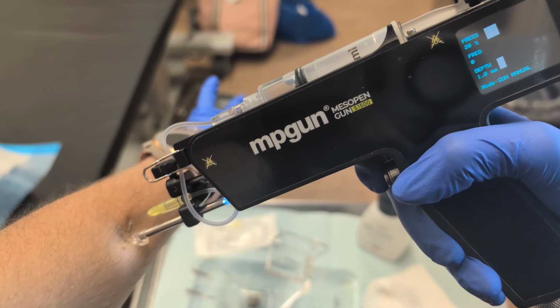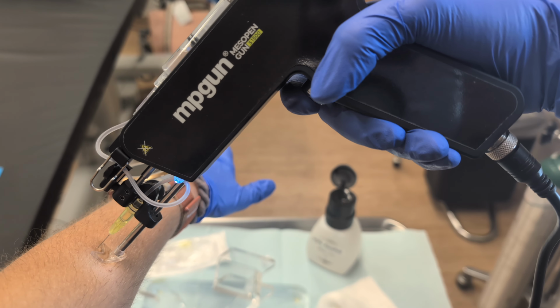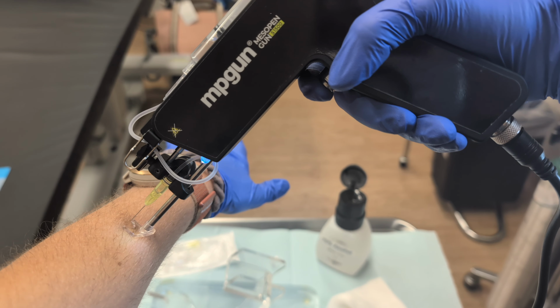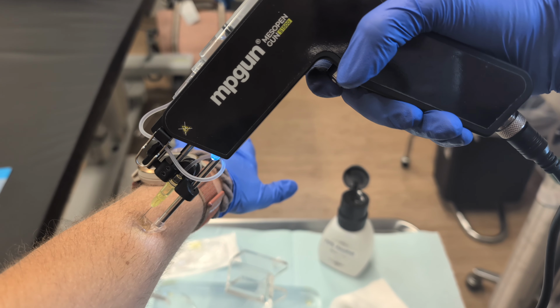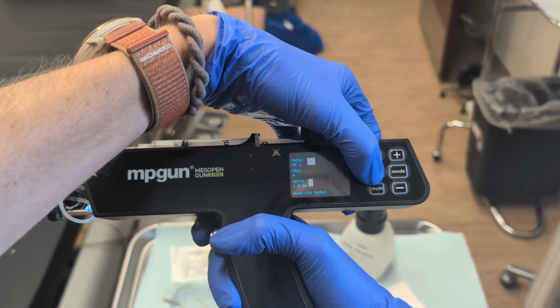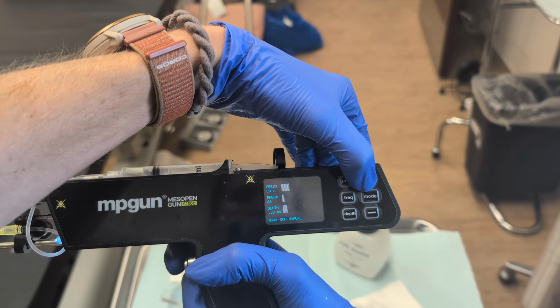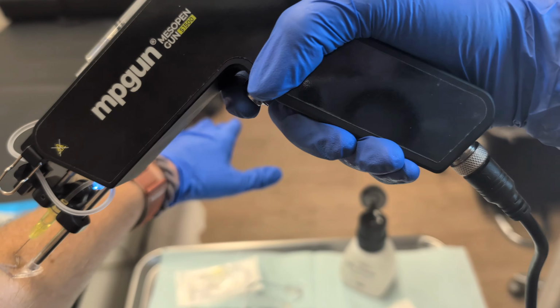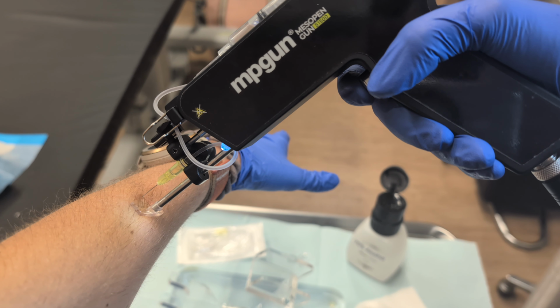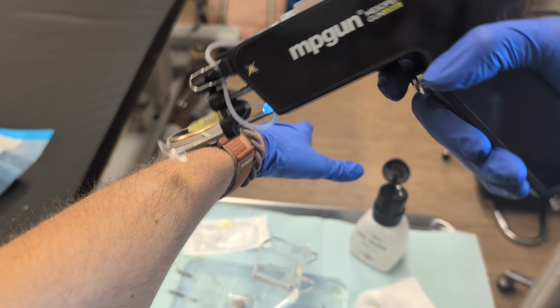Now in manual mode, each time you pull the trigger and you engage the needle, the fluid is released into the skin. The longer you hold down the trigger, the longer the needle stays in the skin and the more fluid comes out. In automatic mode, which again is anything where frequency is above 0, you simply push and hold the trigger. You do not want to continuously press and release the trigger in automatic mode, as this can cause the device to malfunction. That's not what you want. So automatic mode is like cruise control for your car. You push it and you cruise. You do not keep pushing the brake and the gas along the way, right?